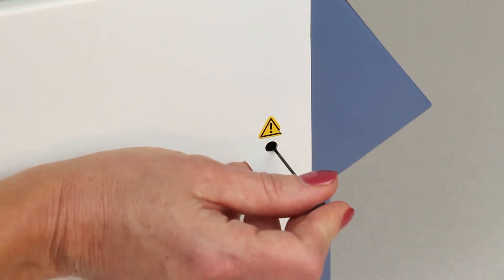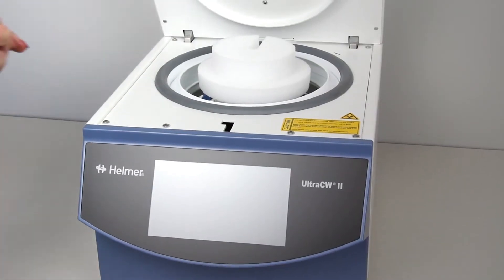Use the tool provided and push the pin in to release the lid. Then remove the packaging material.